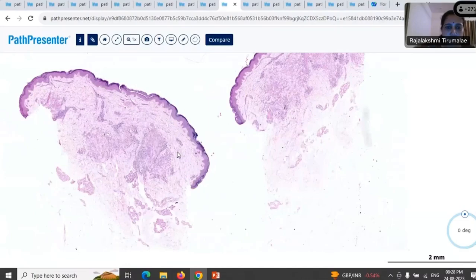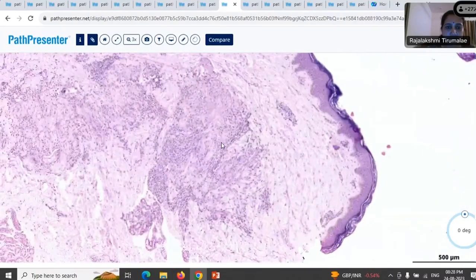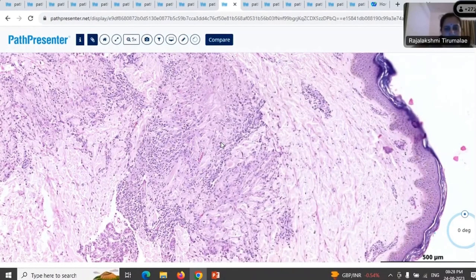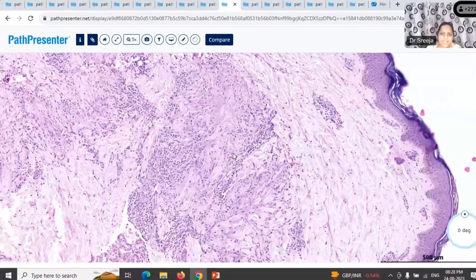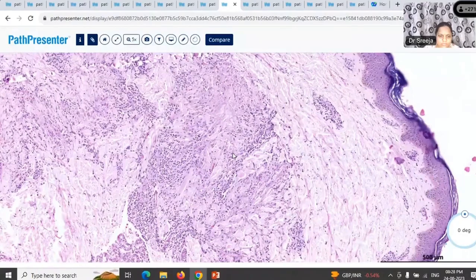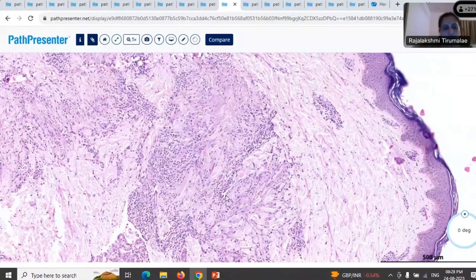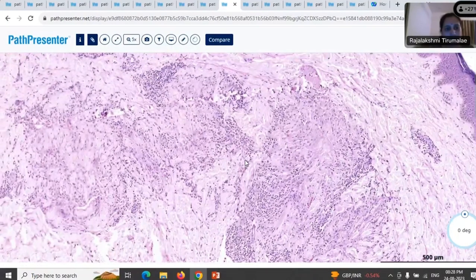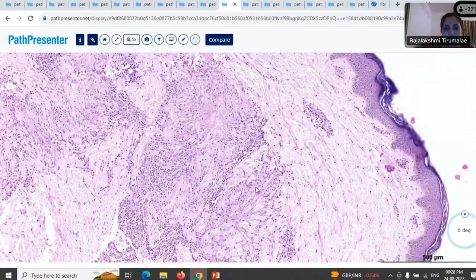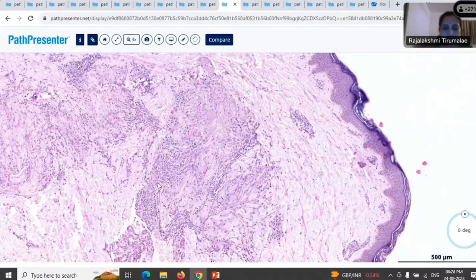Okay, let's go a little higher. Now you can describe it better. Interstitial type of dermatitis, inflammatory infiltrate. Okay, which is the interstitial pattern? Is this the interstitial pattern I'm showing you, or something else? What is this pattern, the one in this field? How would you describe this? There is something in the center and you have this sort of a fence around it. What would you call this pattern?